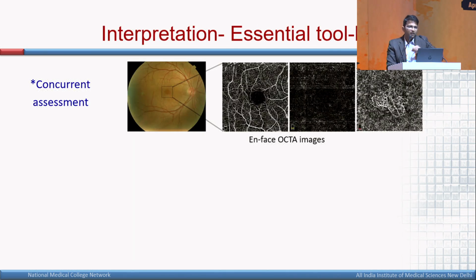Now, how do you interpret an OCT angiography when you have an image on the machine? You don't only look at the en face OCT images; there are different slabs. Commonly you have the superficial vascular plexus, the deep vascular plexus, the avascular zone, and the choriocapillaris. Here in this image you have a full retinal scan wherein the superficial, deep and outer retina have been clubbed together. Then the second image is of the outer retina, and the third image is of the choriocapillaris.